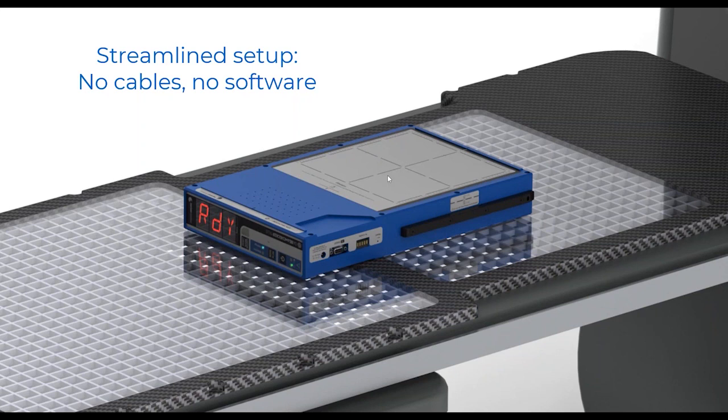The first move would then be to this top white surface, set that at 100 centimeters, assuming that's what your isocenter is at and where you baselined it, set that at 100 centimeters with your ODI, and then put a 20 by 20 field out and verify that those sizes are correct and align the device to that light field. There are also cross lines on the device and markers at various locations to allow you to then verify that the lasers are coincident and lined up correctly with the device.